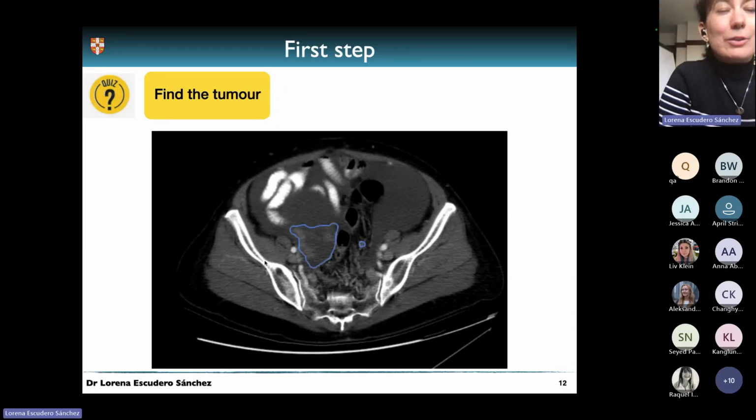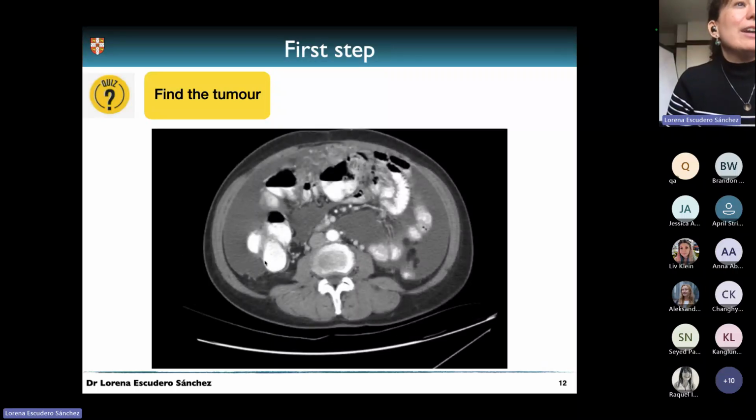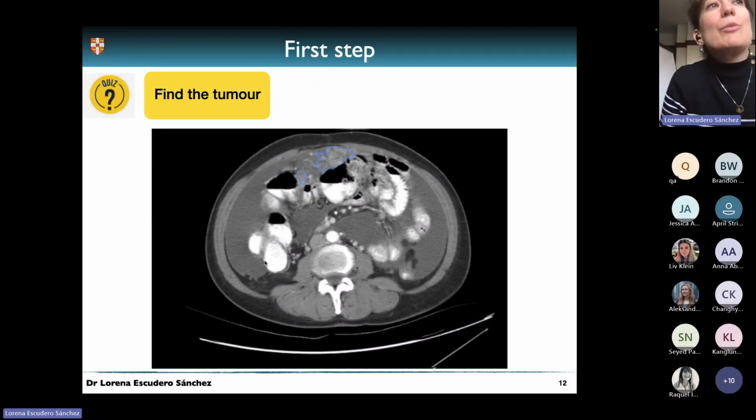It's here. I don't know if you can see anything, if you can see something there. I've looked at a lot of these images and I can barely ever have a sense of where these tumors are. That was an example of pelvic ovarian disease, and this is even more difficult. This is omentum disease and is over here.